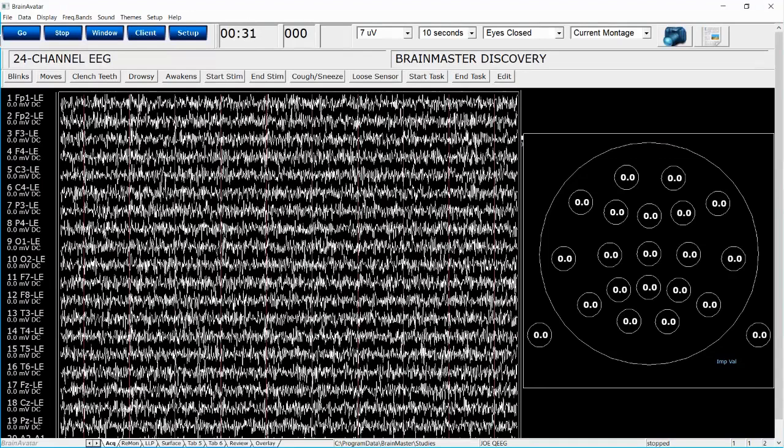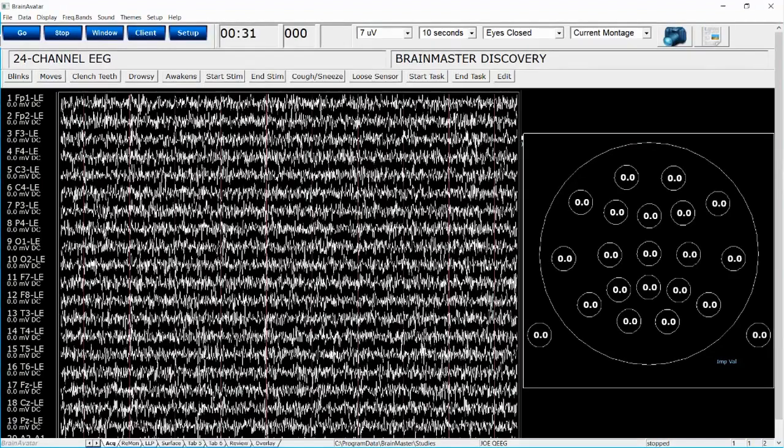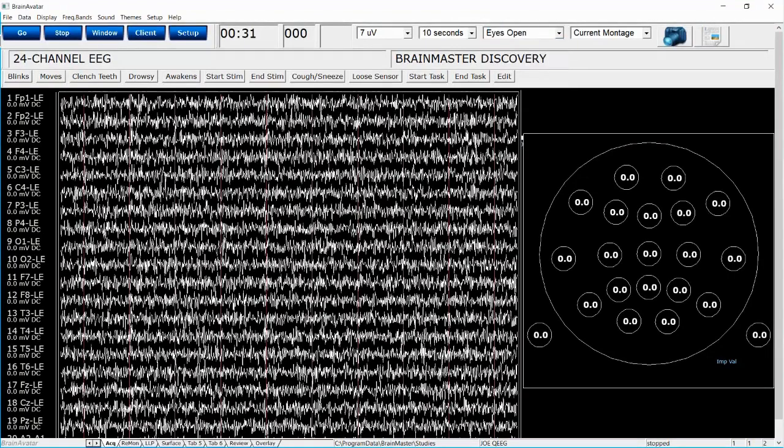with eyes closed. How do we do an eyes opened? We go back and we click on eyes open. And then, of course, we click go.